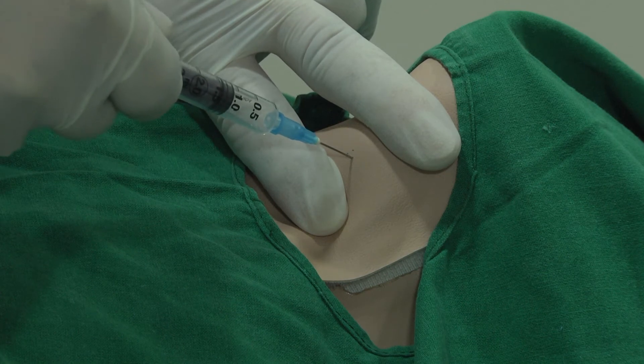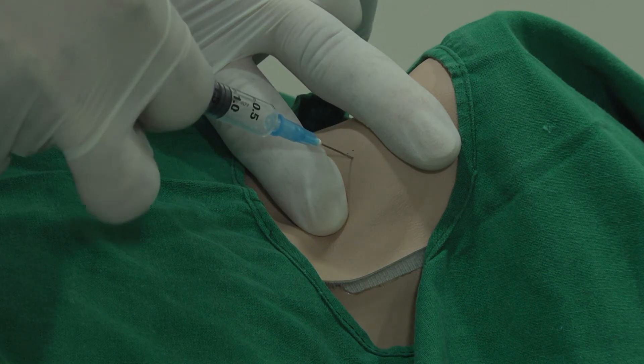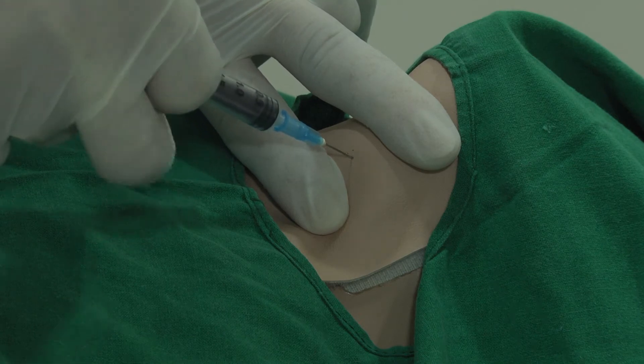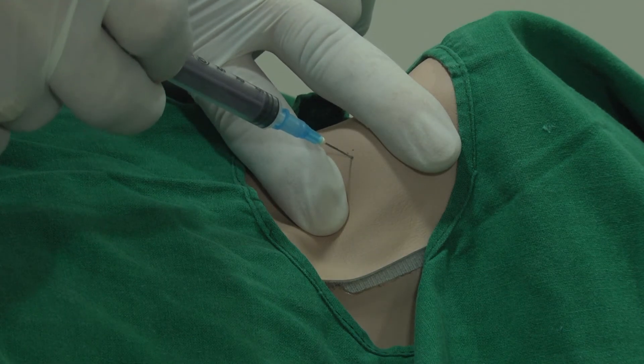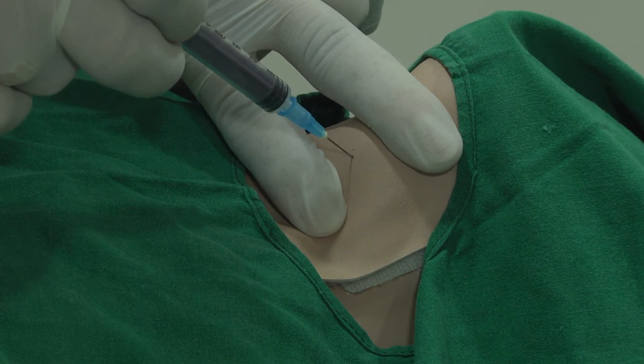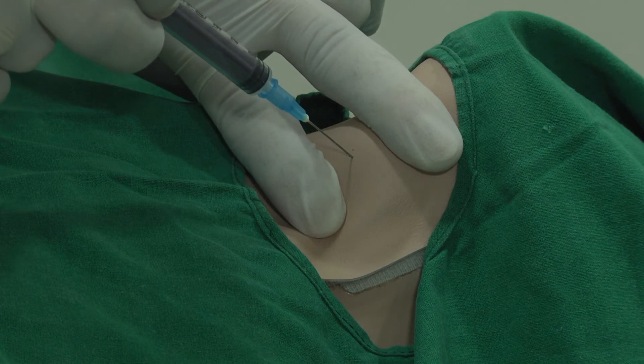Once we notice some material coming in the hub of the needle, the negative pressure is released. Care is taken to see that during the various passes, the needle does not exit the skin. Once the negative pressure is released, the needle is withdrawn.